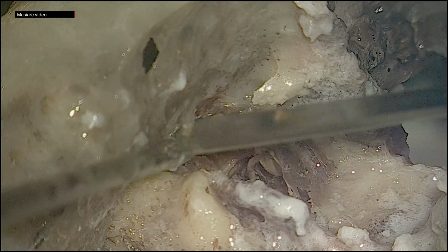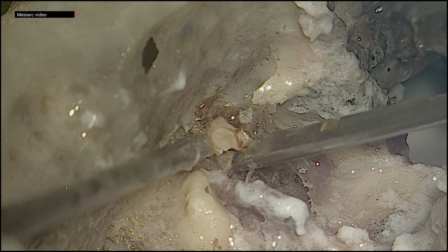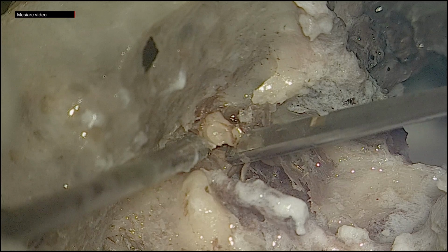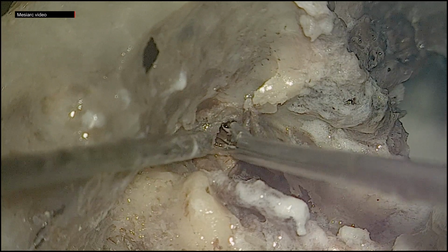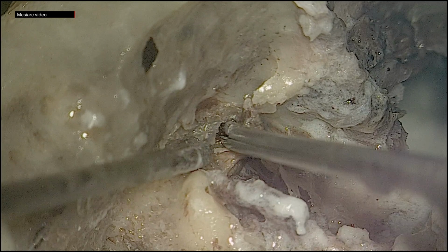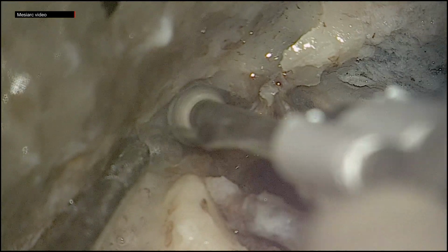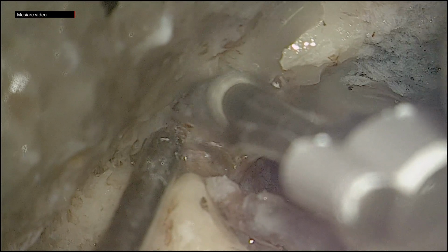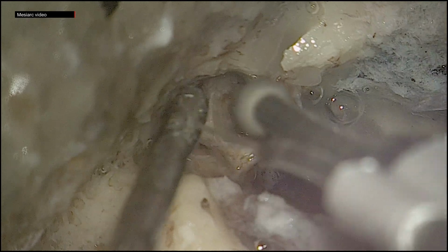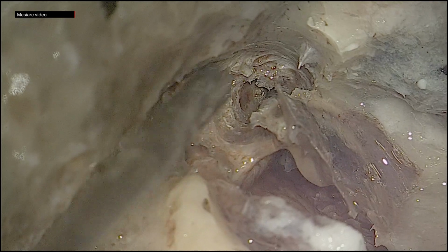Access to the anterior attic is limited by the head of the malleus, which is now cut away by the Hartmann malleus nipper. You can leave the handle of the malleus attached to the tympanic membrane remnant. Now, drilling is done in that area where the supratubal recess is placed.